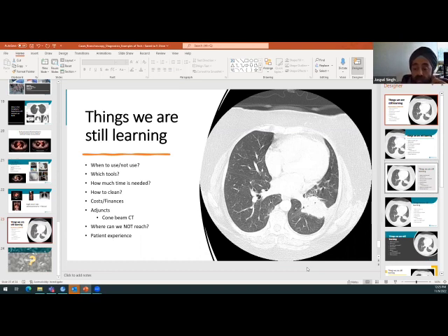And then the other thing that's coming in the pipeline is, I showed, we oftentimes have an x-ray machine in the room and some other technologies to show where we are. We're getting to the point where we now have smaller CT scanners in the room, so we know exactly where we are. But again, that's cool, but the finances of it are difficult.